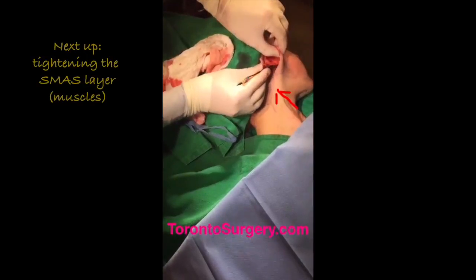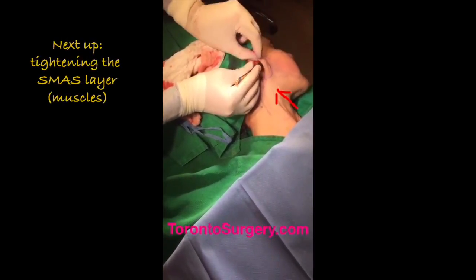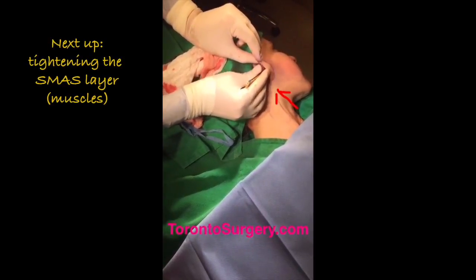I've undermined the skin, and this allows me to take the skin and pull it back that much. Underneath is the SMAS layer — the muscle layer. When I pull in, look what happens over there — I'm lifting her face.